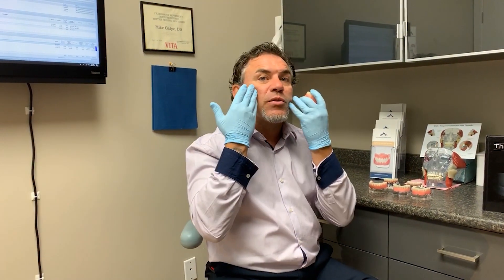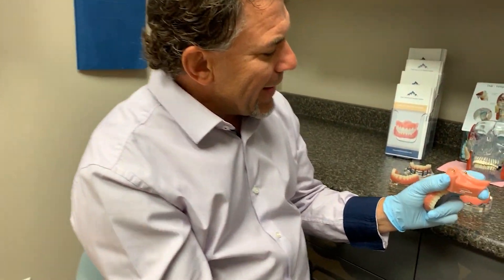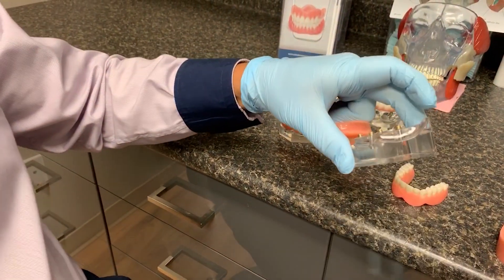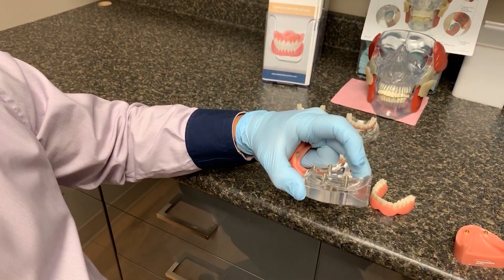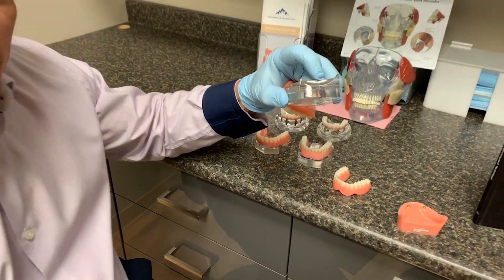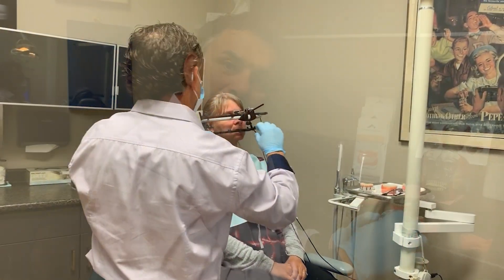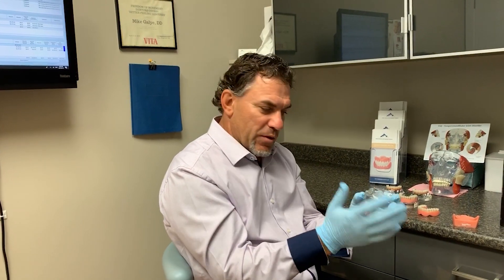That lifting happens because when you open wide, the tissues and muscles all contract. This is what's called a locator implant — the implant is placed into the bone, as you can see on the model. There's a little incision in the tissue, the surgeon places the implant, and it takes about three to four months of healing. After healing, a silver cap is placed on top. We measure from the base of the implant to the top of the tissue, and position the gold locator abutments about two millimeters above. The advantage of locator abutments is that they're interchangeable — you can take them off and put them back on if there's wear.